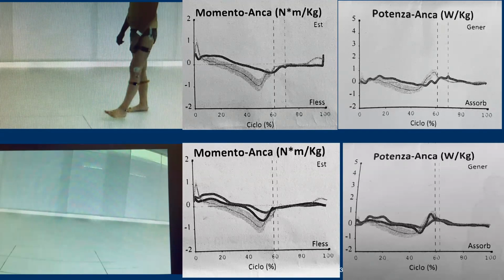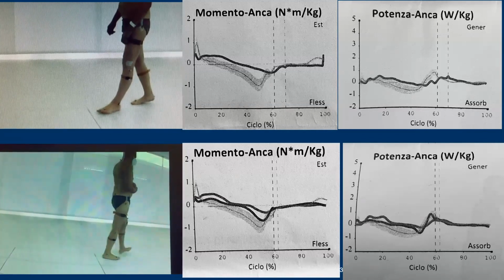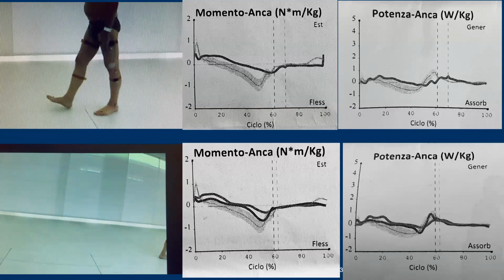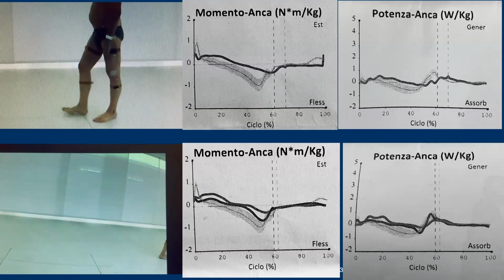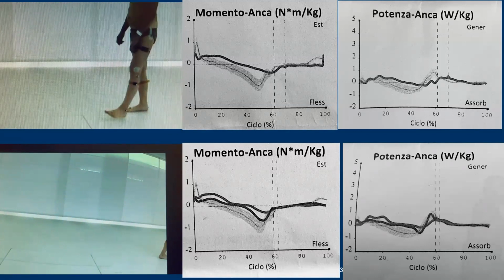And after the period of stimulation, you see the walking is more fluent, it improved a lot, and the patient restored the normal extension of the hip, and the extensor hip muscle can absorb the force and push the power and the strength on the floor.